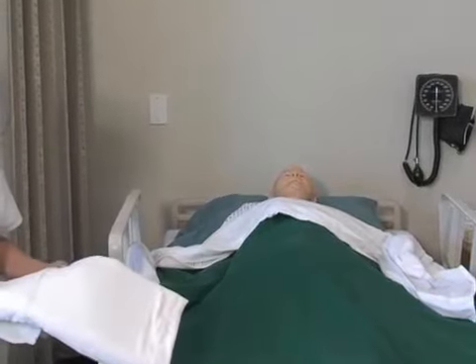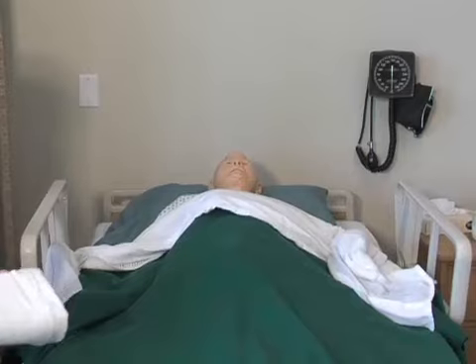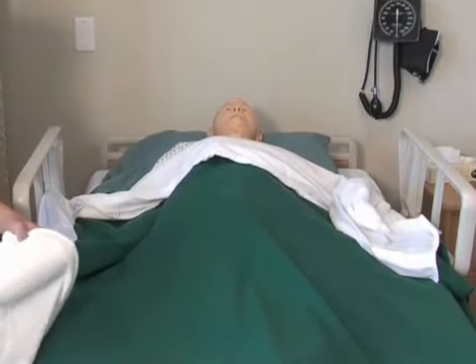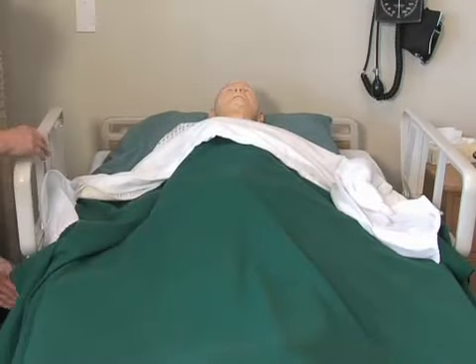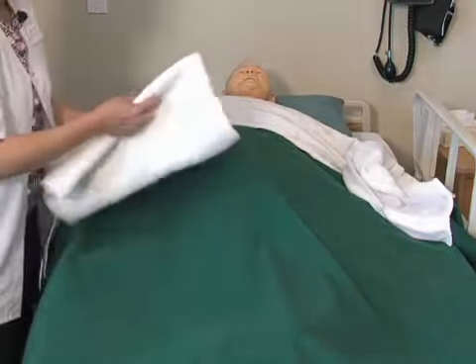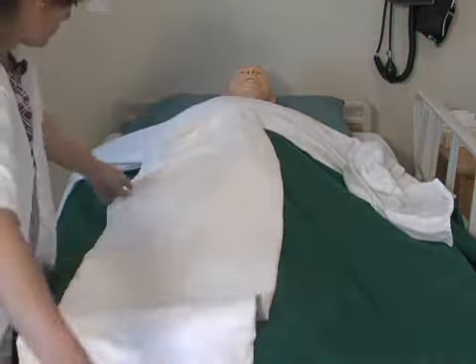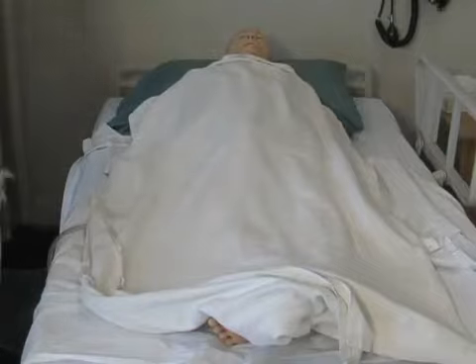It's important that you provide as much privacy as possible for your patient. However, just for the purpose of this procedure, I will uncover the patient so you can see exactly what I'm doing. I'm going to lower the bed here. And I will apply the bath blanket. I'm going to put my gloves on.